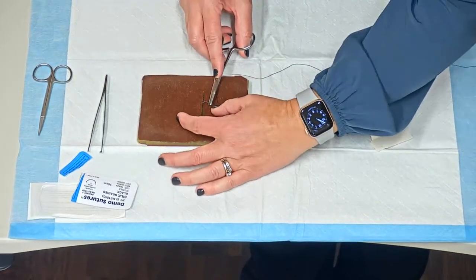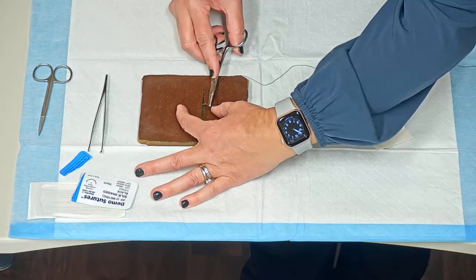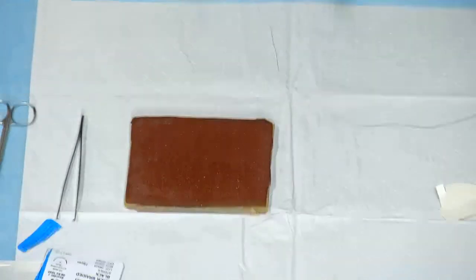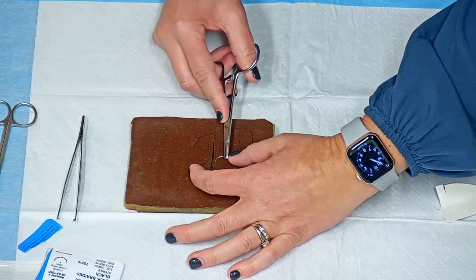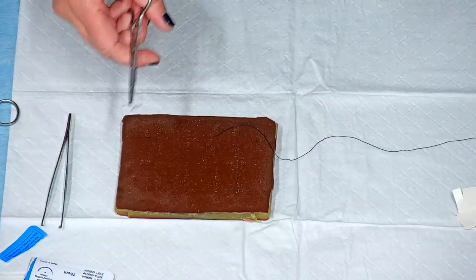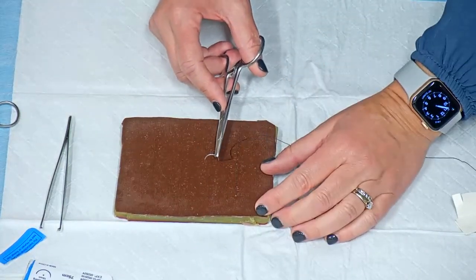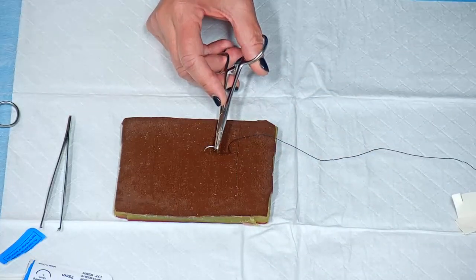As we approach it, I'm just going to open it so you can see a little bit where the line is. You want to go about 5 millimeters lateral of the incision. As we think about going down, some of the key principles are that you want your input and where the needle comes out to be equidistant so that there's no pulling to one side or the other. And as we move up and down, we would also like those to be really equidistant. The closer they are, the more scarring that you'll have.